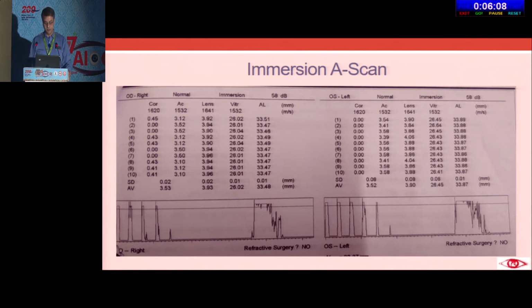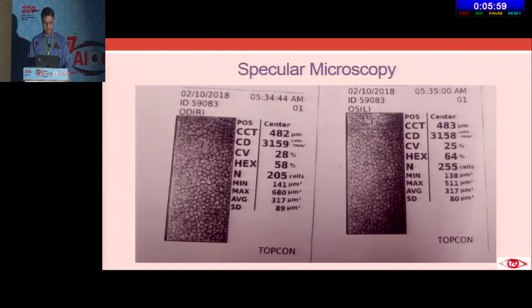And of course, I need some other method to find the corneal thickness, CCT, and subtract it from the ACD to get the AD. So this is what I used for the CCT. The specular was also pretty good.